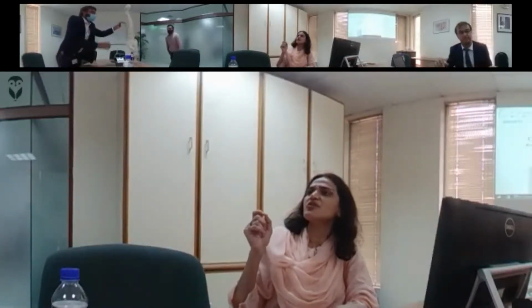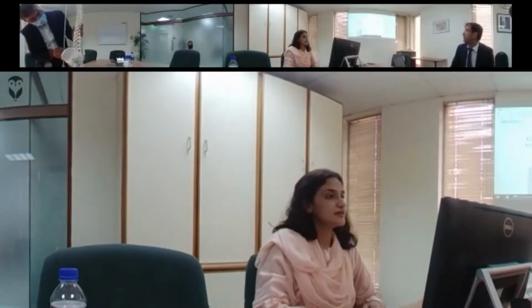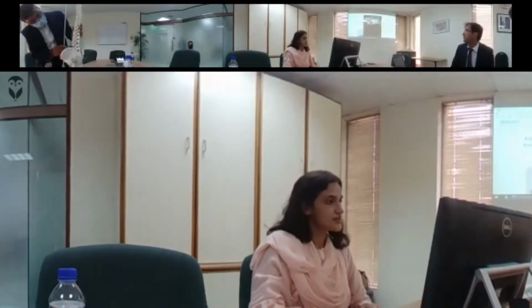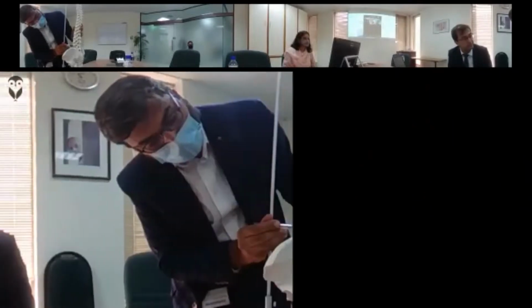So once you're on the lateral, you're taking a lateral image, you can see the foramen, and mind you, it's two laterals. Once you're seeing that, if you can demonstrate it on the spine model, because here a very key concept needs to come in. For example, that's L5, let's take L4. You see the nerve roots are going down there. In the supraneural area, you have a lot of room there.